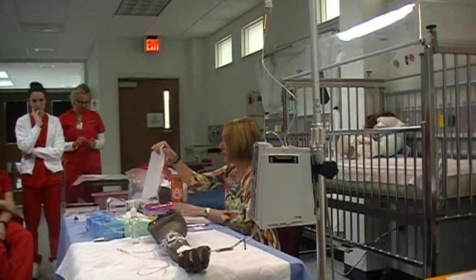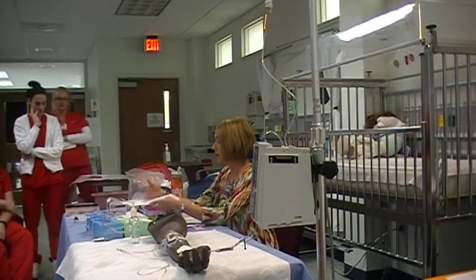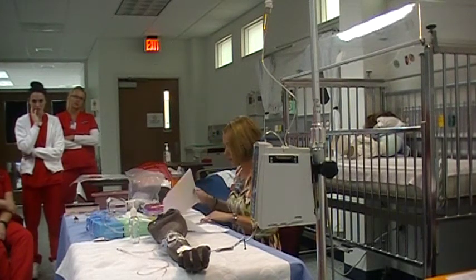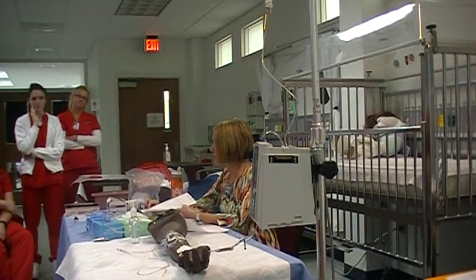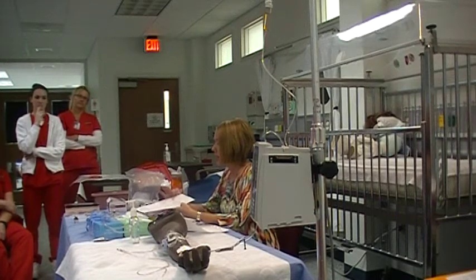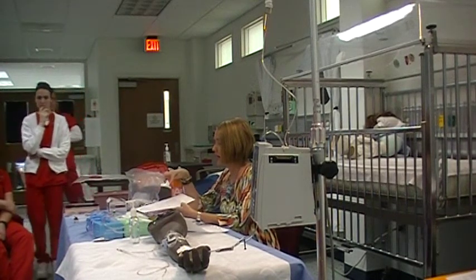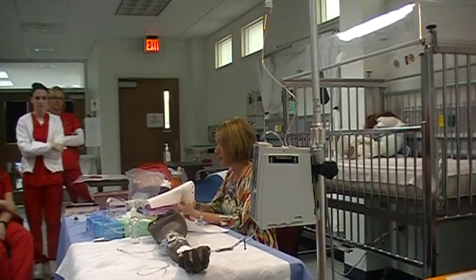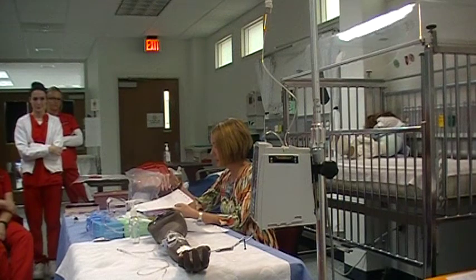I'm going to hand you this, and this is your MAR. Okay? So your MAR will be here, and you'll tell me, okay, let's use a different one than we just used. Here's one, and you'll say, okay, the patient that I'm going to give the medication to is Mr. Davis, and he is going to get Lasix 20 milligrams IV push now. And so that's going to take care of verifying the patient's identity with 2 identifiers while we're here. Now, that's going to happen at the bedside as well, okay? But you're going to tell me that you know it's for Mr. Davis, and that's what we're going to do.